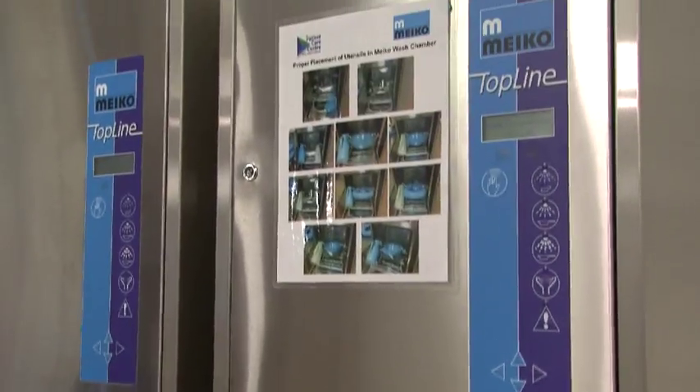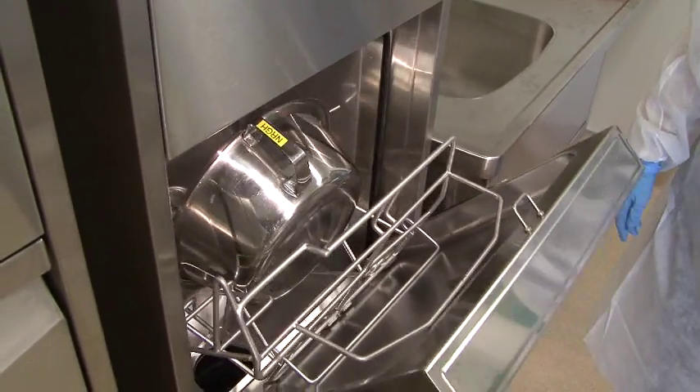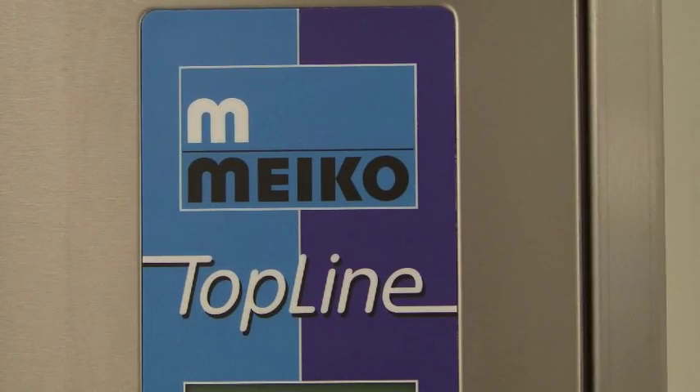On the nursing units, soiled commode pots, bedpans, slipper pans and urinals can be safely emptied, disinfected and dried with one touch using the Meiko TopLine bedpan washers.